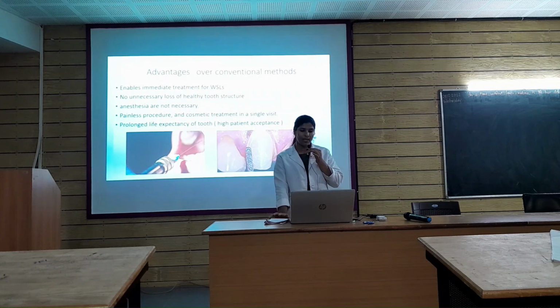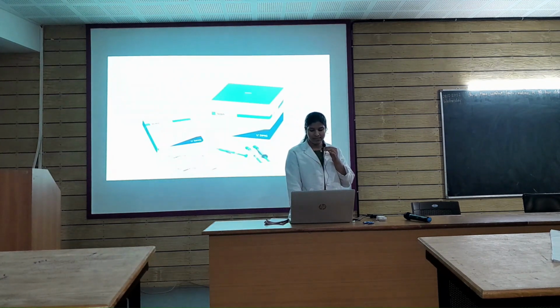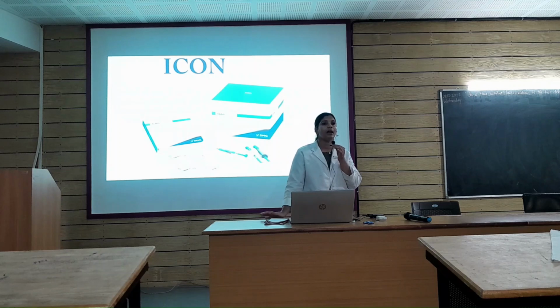The anesthesia is not required, and it's a cosmetic procedure, a treatment that can be done in a single visit. In cases where the patient has high acceptance, it will occur for this procedure. And coming to Icon, it's a brand name given by the DMG company.